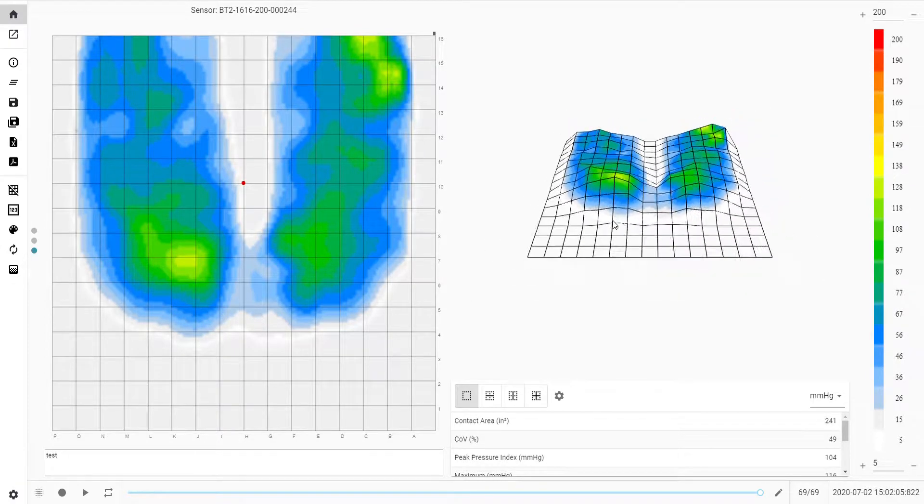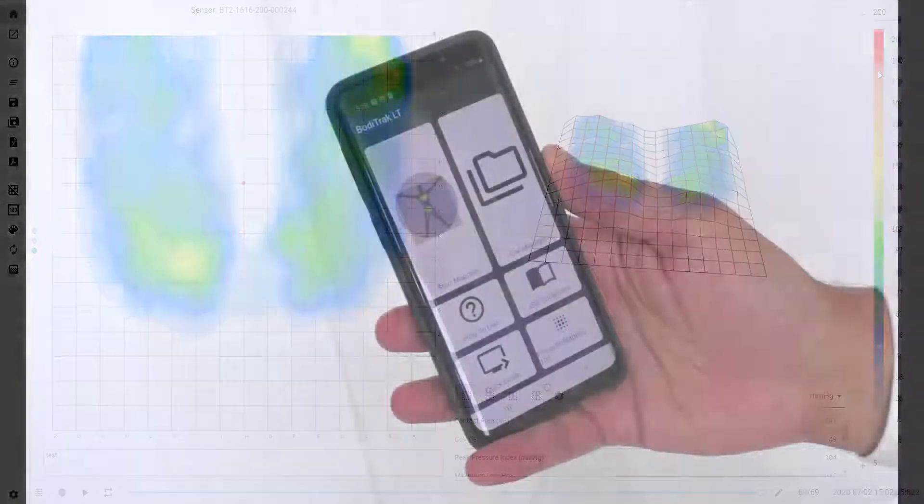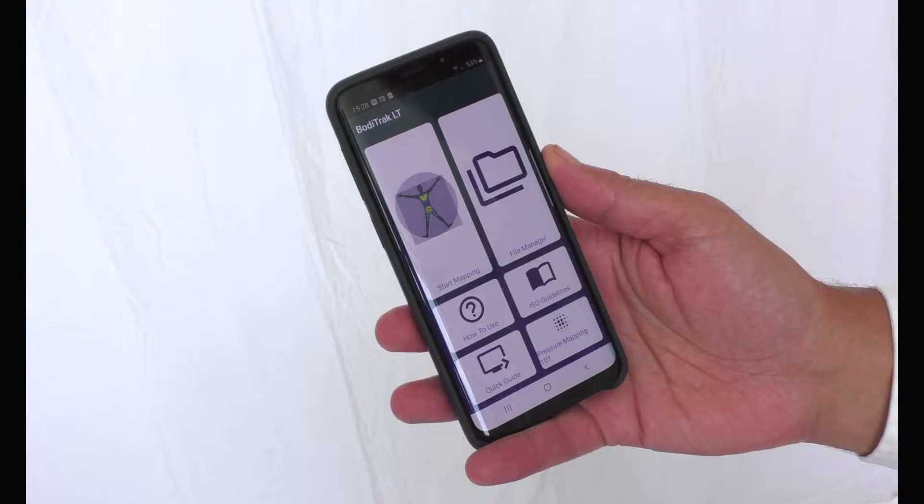BodyTrack is available in Lite and Pro versions. Pro is more of a clinical tool with in-depth statistics and measurements. For a quick visual assessment without in-depth clinical data, the BodyTrack Lite is a cost-effective option that presents accurate readings and can be used on your phone.